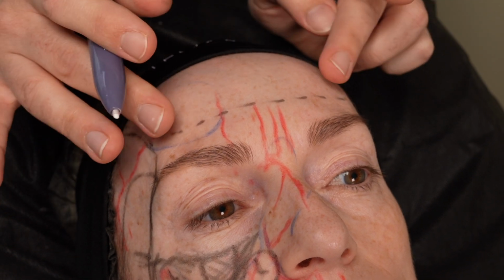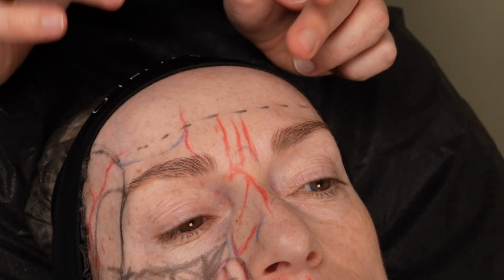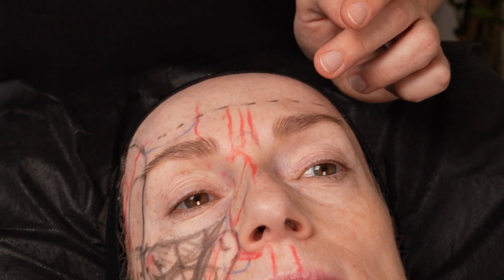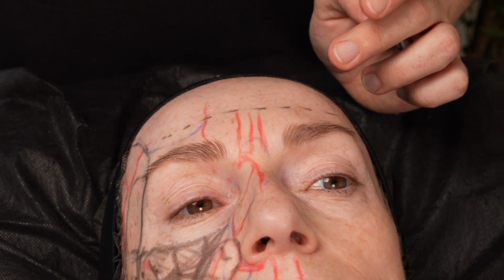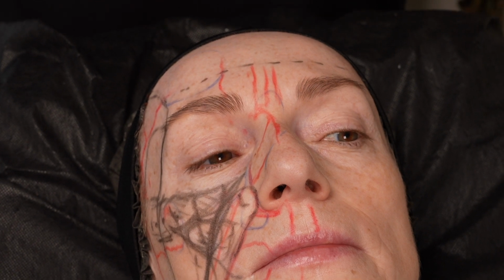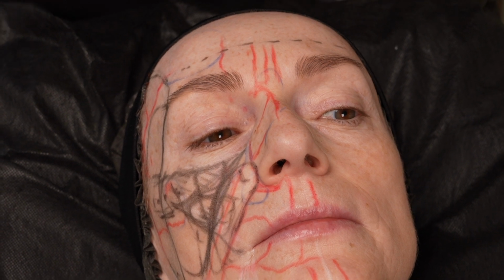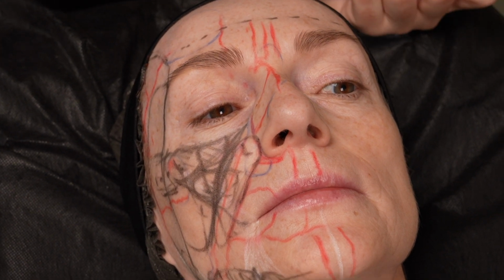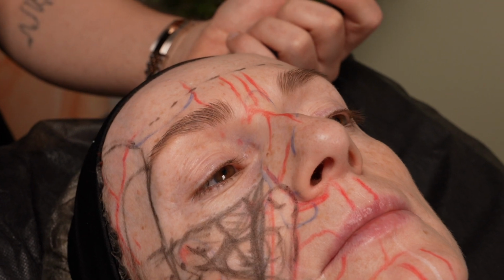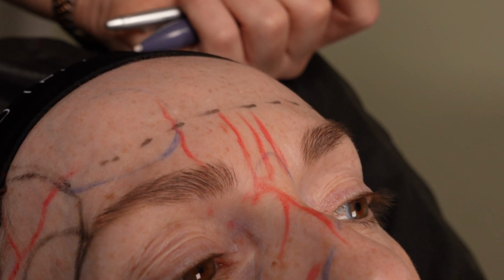You can also work with a cannula, again in deep tissue, underneath the muscle. Also, you can work with a needle, multiple points, but you have to be underneath the fat tissue, deep underneath it, above the supraperiosteal level. That's why if you inject with the needle, you have to be careful of the opening of the needle, because in the cadaver courses we just do 90-degree injections. My dyed hyaluronic acid is even inside the subcutaneous tissue. That means in the layer of the vessels.